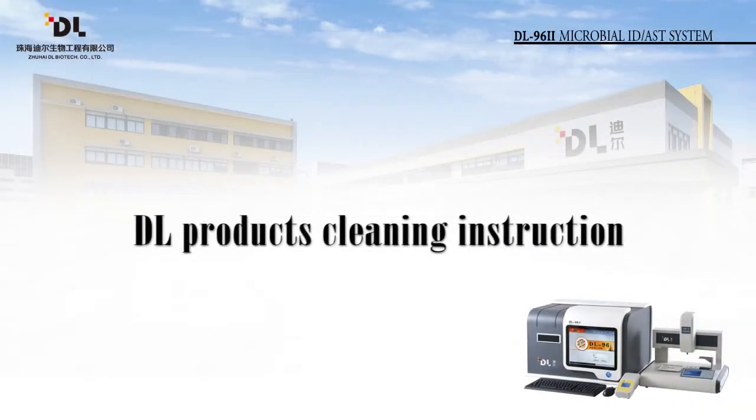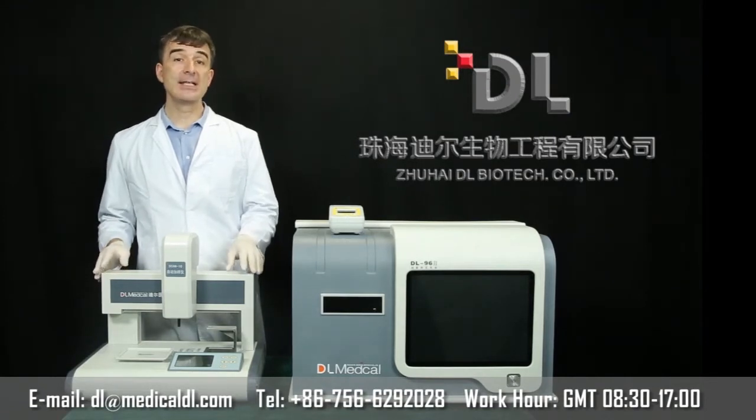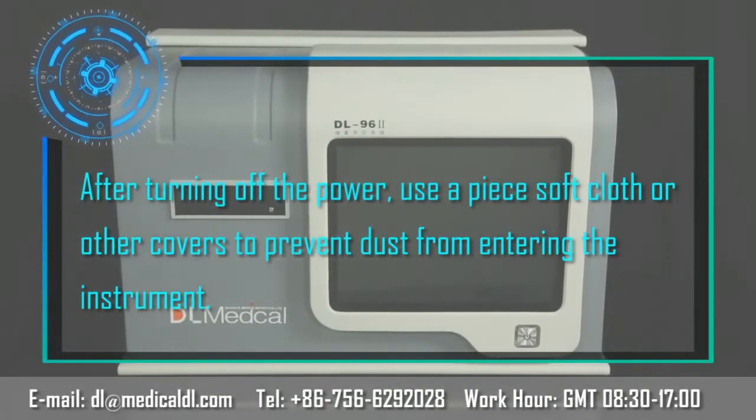Section 4. DL Products Cleaning Instruction. After using the instrument, it should be wiped clean. Abrasive cleaners are not allowed. After turning off the power, use a piece of soft cloth or other cover to prevent dust from entering the instrument.